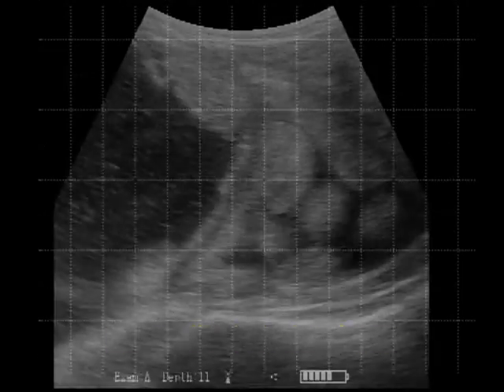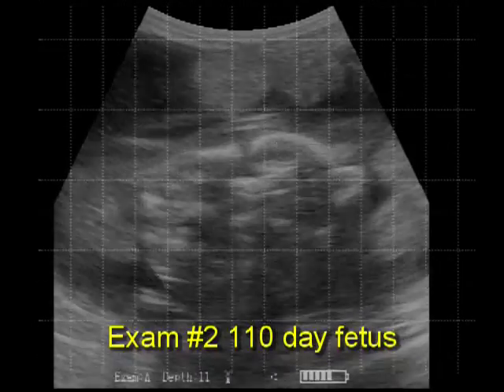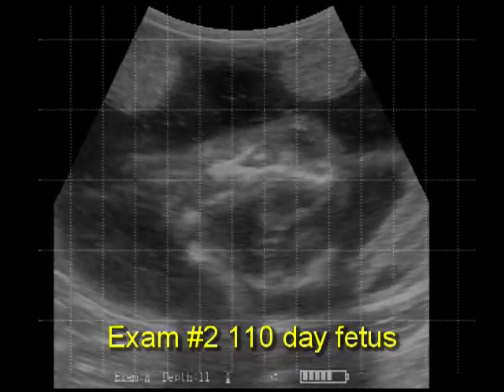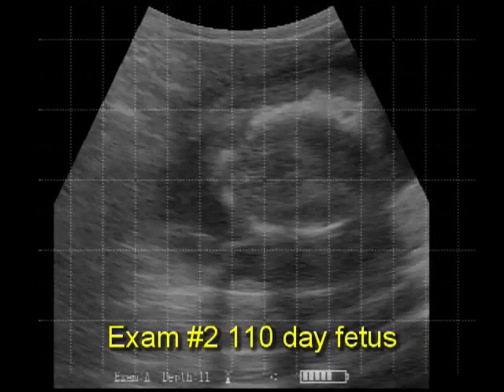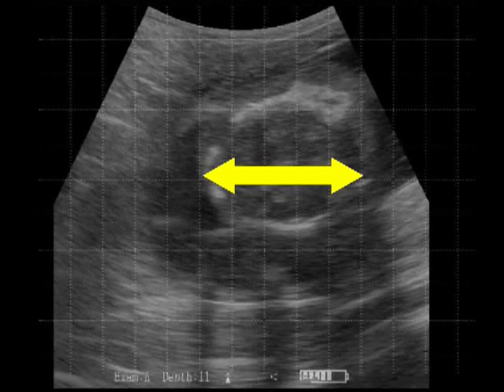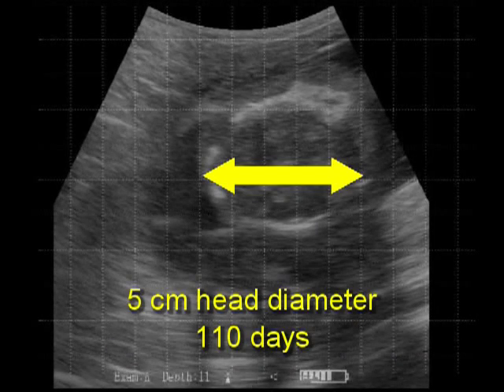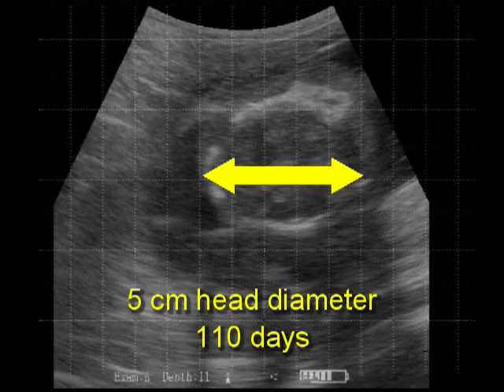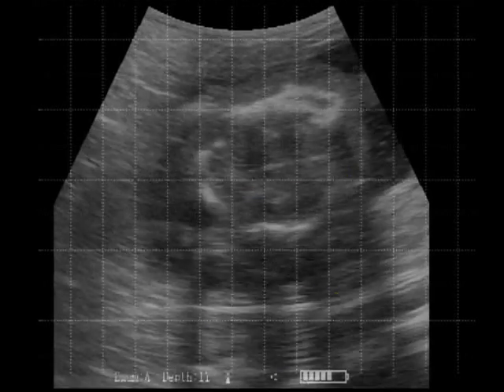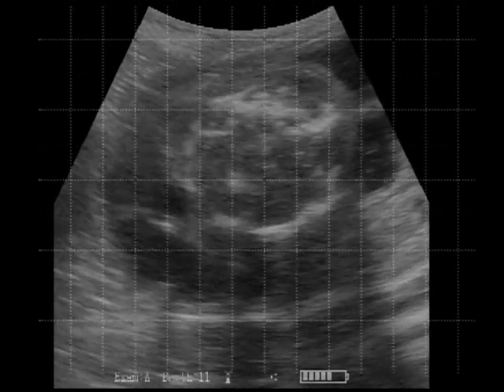In exam 2 we have a 110-day fetus. We will try to get the largest, clearest head diameter. There we are at approximately 5 centimeters for 110 days.